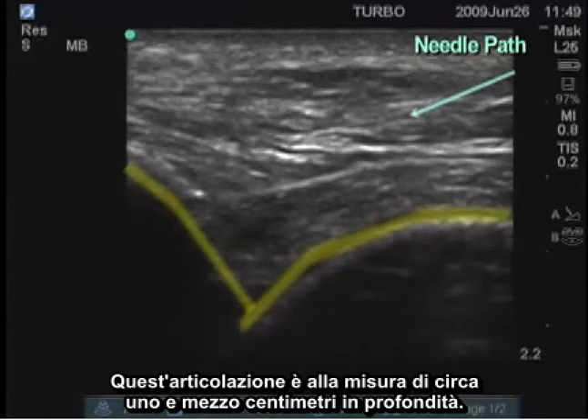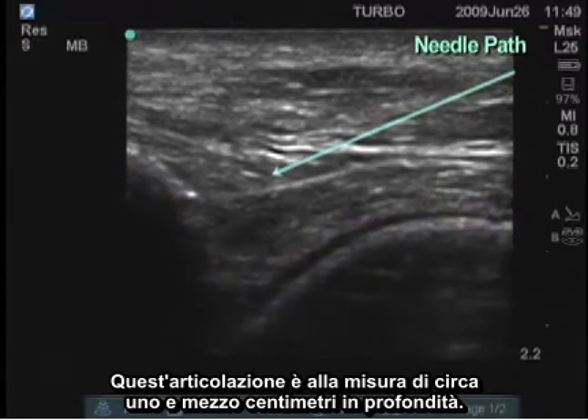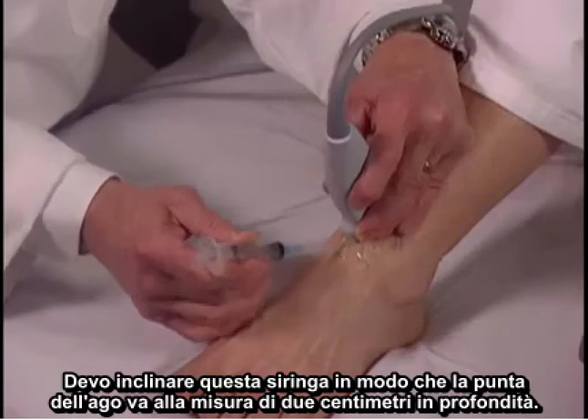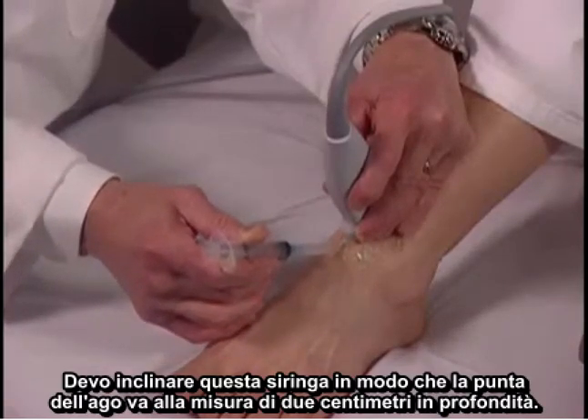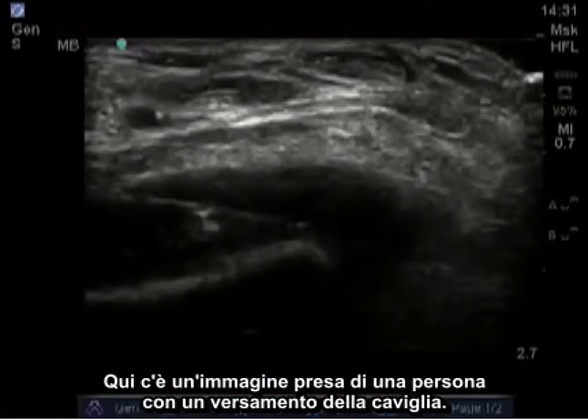This joint is approximately one and a half centimeters deep, so I'm going to have to angle this syringe such that the tip of the needle goes to a depth of two centimeters.